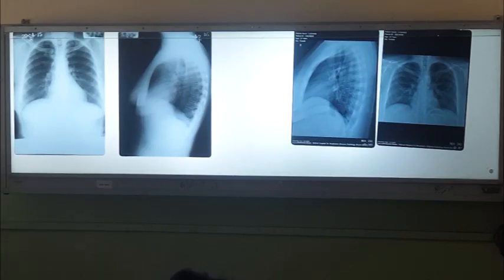The other thing is, there are various terms used by radiologists, right? Homogeneous opacities, ill-defined opacities, well-defined opacities, then cavitating lesions, consolidation, miliary shadows, nodular opacity, like that. Radiologists use various terms, and some of these terms have a specific meaning. If you say consolidation, there should be an opacity with air bronchograms. I will go through other X-rays; I have enough examples.